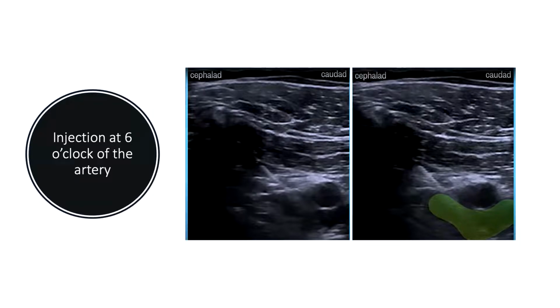Now, if the local doesn't do this, notice that, as you may have experienced too, in younger patients there is less adhesion, so the local anesthetic travels far and opens planes very easily. But in older patients, there are more adhesions, and it's more difficult for the local to travel a certain distance. So sometimes you will have to remove the needle from there and go directly to the other side of the artery to do your medial cord.